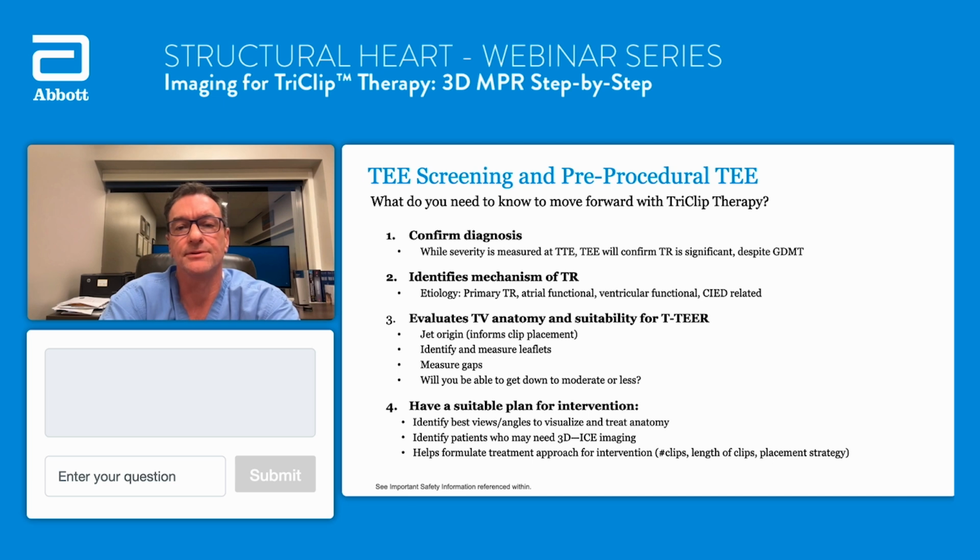And we have to get down to moderate or less as a target, and you have to have some reasonable expectation that you can put a clip in a sufficiently strategic place or several clips to achieve that goal. You have to have a suitable plan for the intervention. So that includes what are the views that are best? Is it a short axis view? Is it a mid-esophageal view? Is it a deep transgastric view or a deep esophageal view? Sort of understanding that. And ultimately being able to predict which patients might need ICE, intracardiac echo, as an adjunct to TEE to effectively perform the procedure.